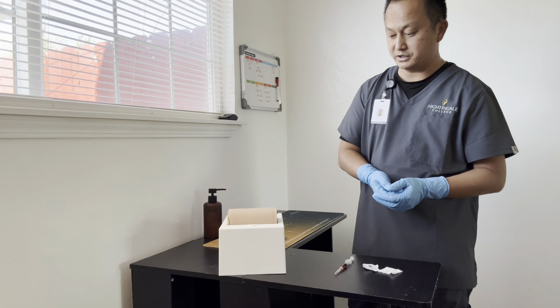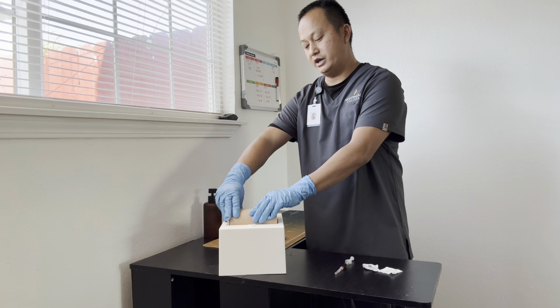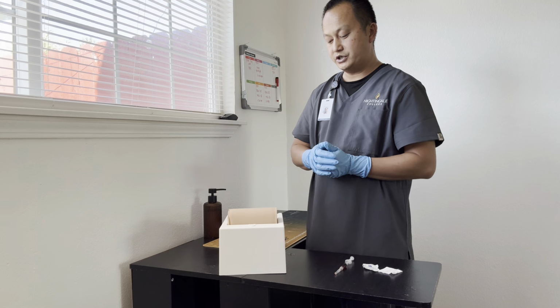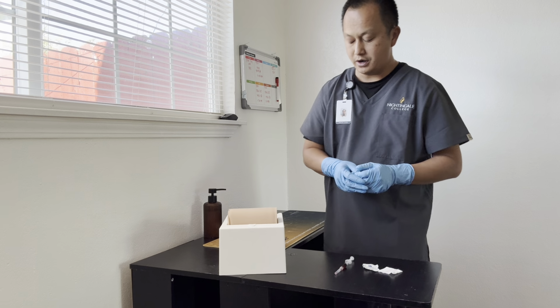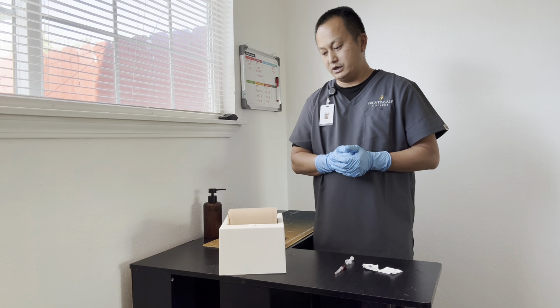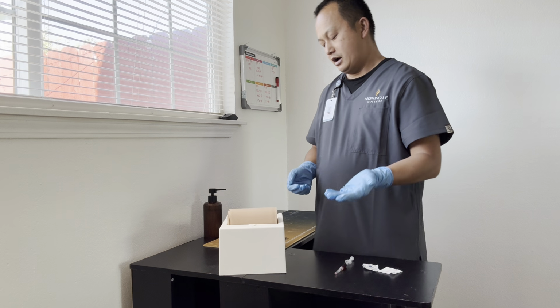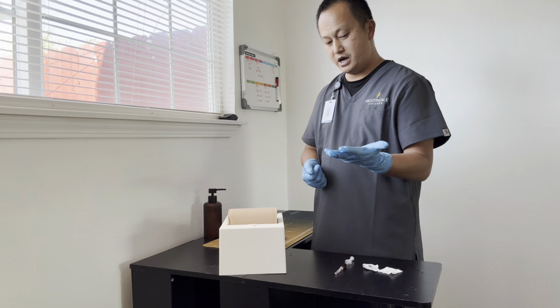I will then check for any bruising, skin irritation, or edema on the site. And then we are also palpating for any tenderness or hardness. We're also checking if the site has been used often. If it has, we will rotate to a new site. And then after everything has been completed, we will mark our site by using our non-dominant hand here.